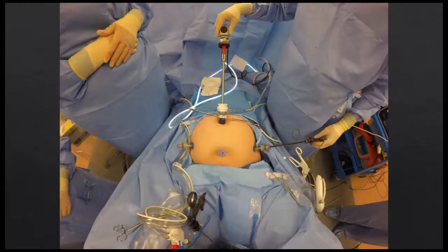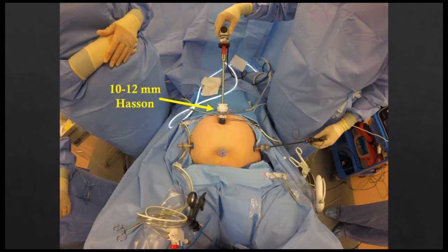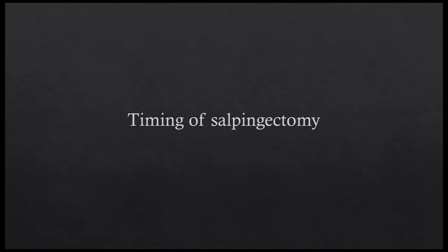Tips and tricks for performing a salpingectomy during laparoscopic hysterectomy. For hysterectomies performed at our institution, we use a four-port configuration consisting of a 10-12mm umbilical trocar placed using open technique, two 5mm lateral lower quadrant ports placed under direct visualization, and one 5- or 10-12mm suprapubic port placed under direct visualization.